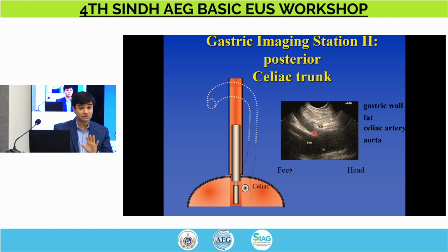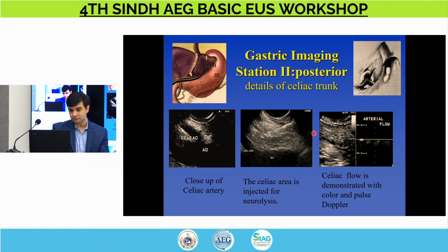If you're questioning anything, particularly when it concerns vascular involvement, throw on a power Doppler, and we'll go over that setting. It'll allow you to make the difference between an artery and a vein, pulsatile versus non-pulsatile, and even things like the portal vein and the hepatic veins. And we'll go over that also.